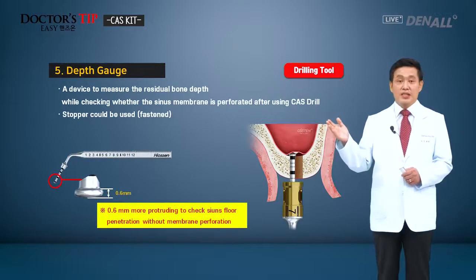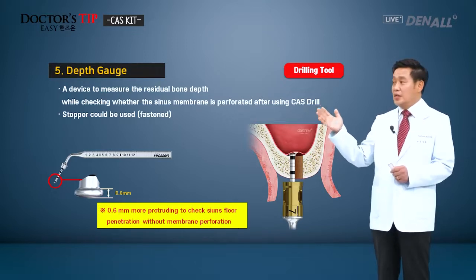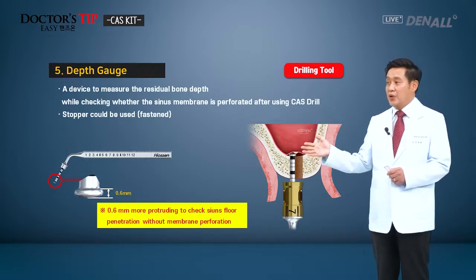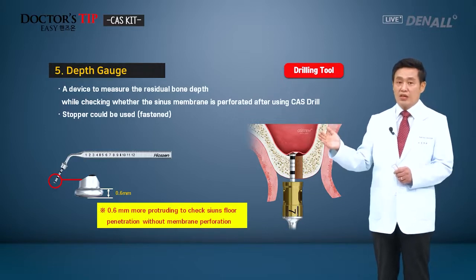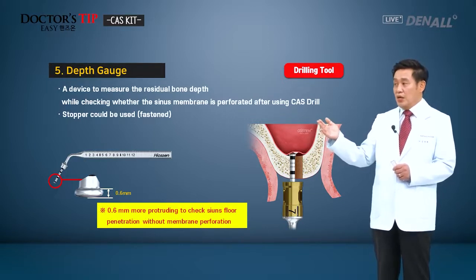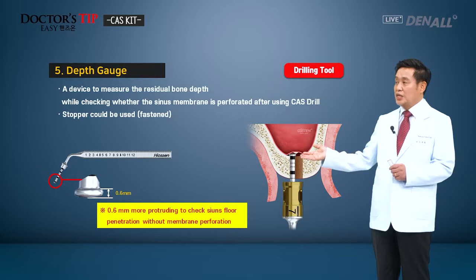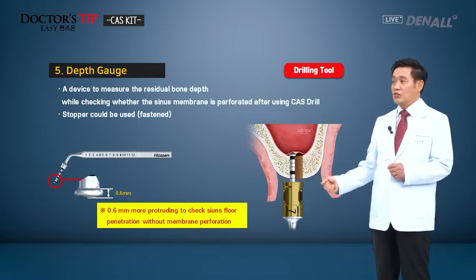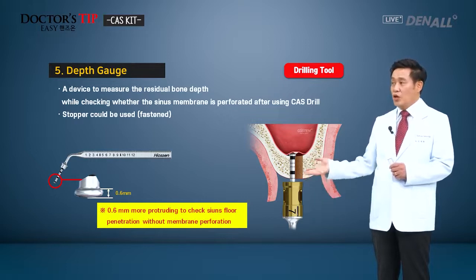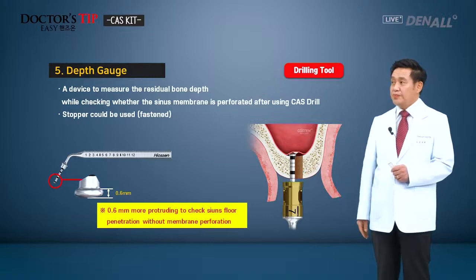Next, the depth gauge. As I said before, the same length stopper used for the CAS drill is connected here, then it protrudes 0.6 millimeter more. After the drilling, this can be used to check whether the sinus floor is penetrated or the membrane is damaged using tactile sensation. So the stoppers can be connected here as well.